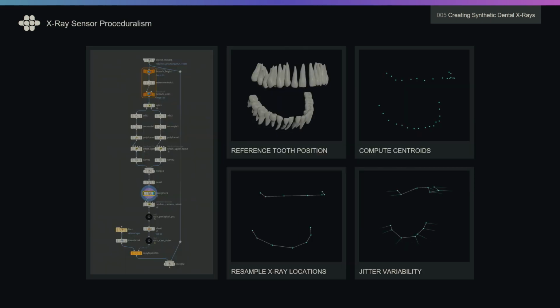The next thing is understanding how radiographs are captured. The radiation source is placed on the outside of your mouth and the sensor on the inside. This can introduce some variation if it's not placed quite correctly. You'll get some interesting distortions from that. Or if the radiation source and the sensor are misaligned, you'll also get distortions from that. It's kind of like using a large format camera, if anybody's familiar with that, if you offset the film plane and the focal plane.